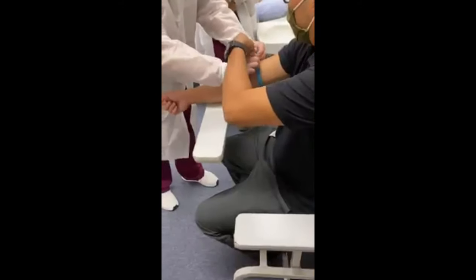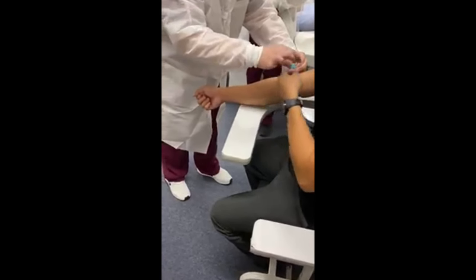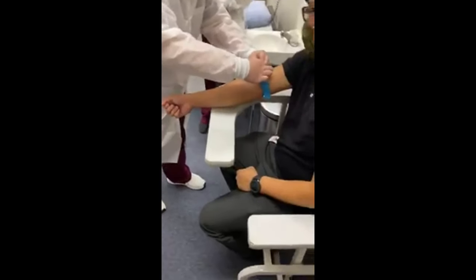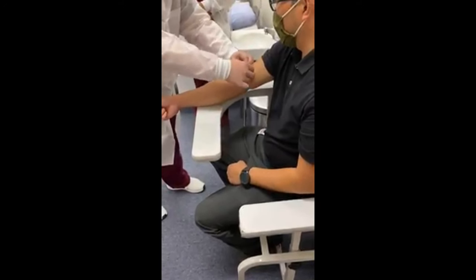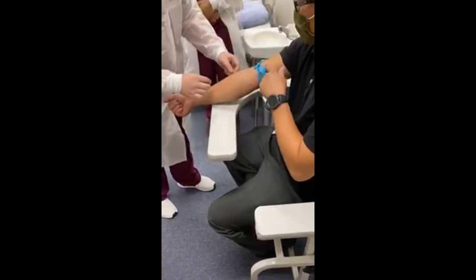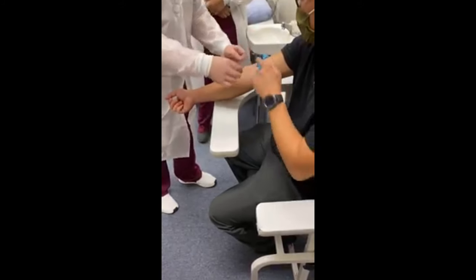And then you cross it over? Yes. Cross it over and then this one here goes underneath. So it goes over and then under. Yes. And then you have your bunny ears there. This one here, just maybe a little bit higher. Yeah, it's good tension.